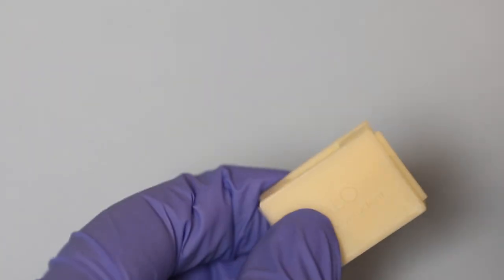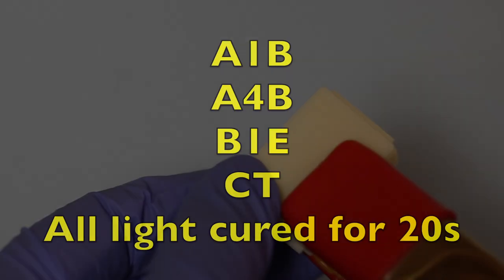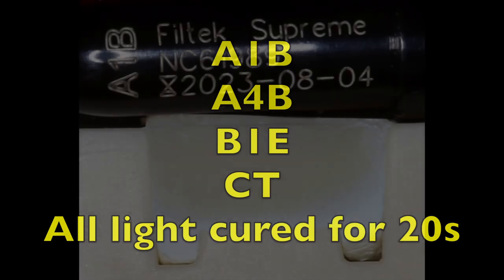The composite does not stick to the walls of the cavity and can be easily removed. In this video we are looking at four shades of Filtec Supreme.